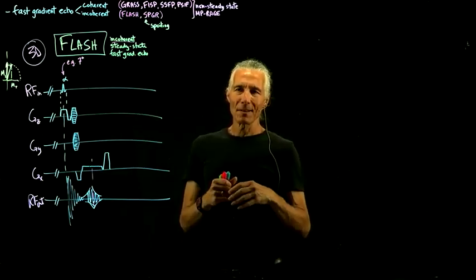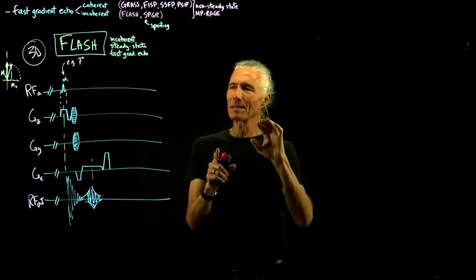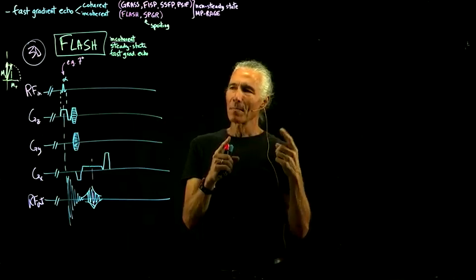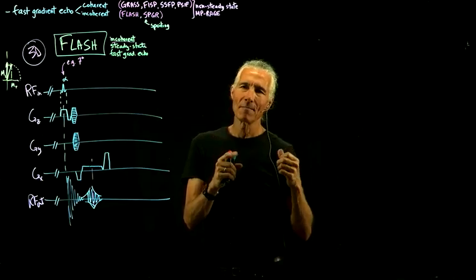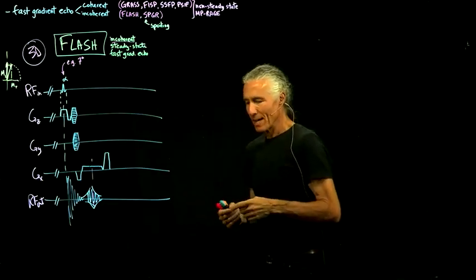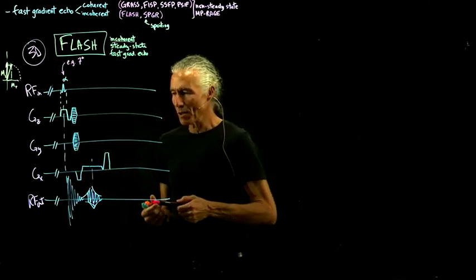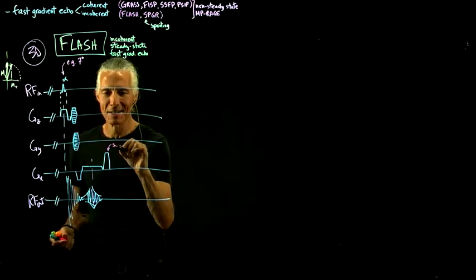And what does that do? That's like a really T2 star. It really reduces the signal from it, because as you wrap it up, more and more cancellation occurs because everybody's out of phase. And so you can think of that as what you call a spoiler.